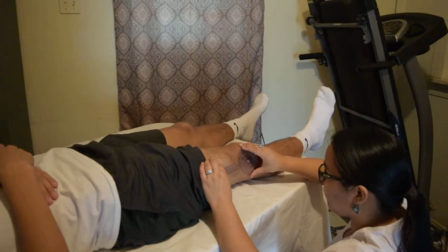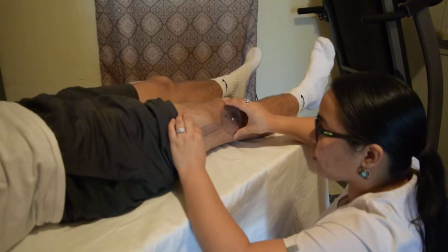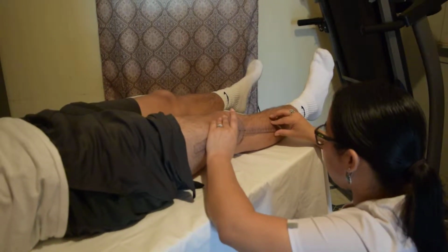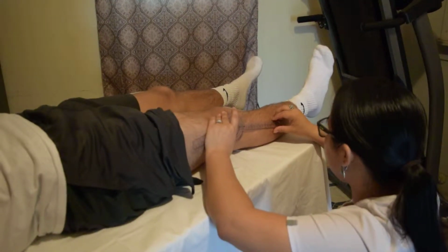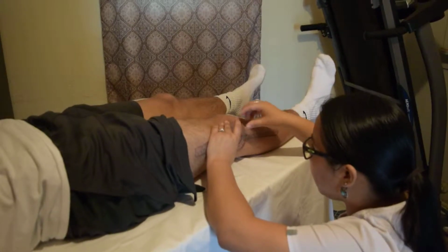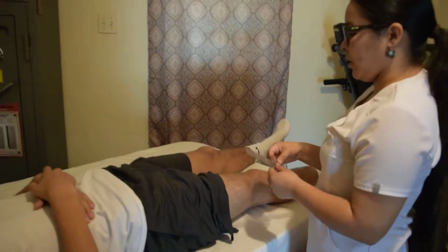So I'm going to line the proximal arm to the greater trochanter, and then have the moving arm lined up to the lateral malleolus, which here the degrees measure 0 to 5 degrees.